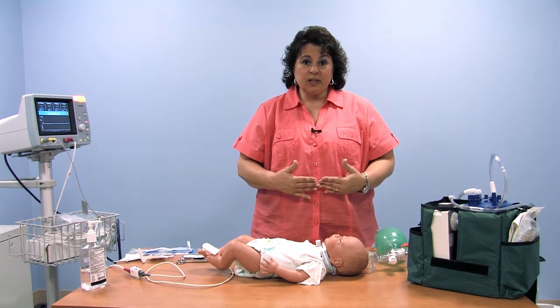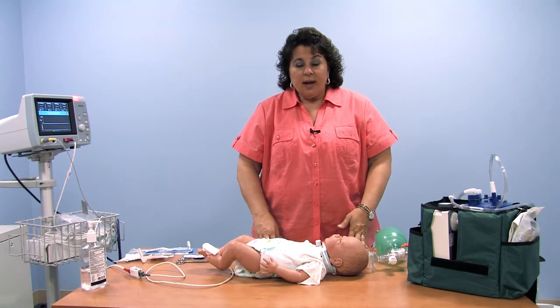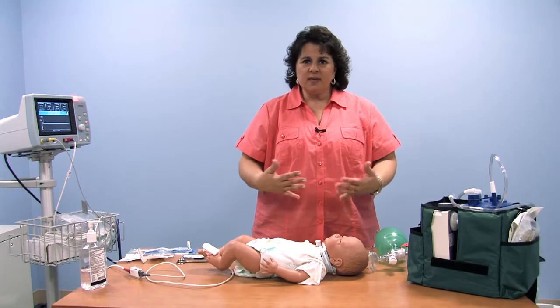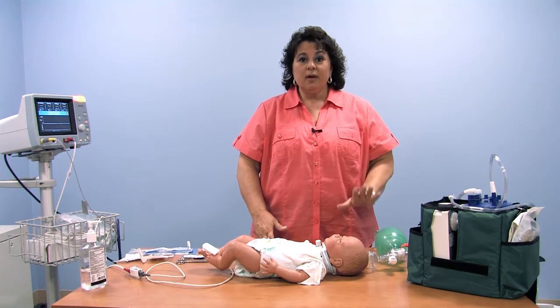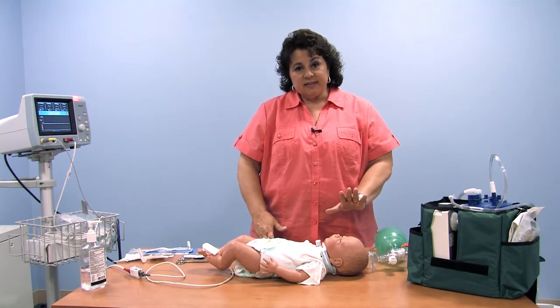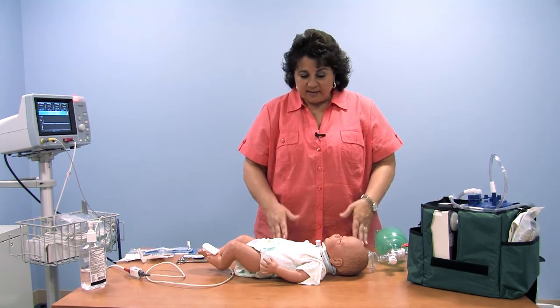Typically, before you leave a facility to go home, you will have all this equipment in place. These are things that you should carry with you in what we refer to as a go bag, so that a child with a tracheostomy tube doesn't travel anywhere without certain pieces of equipment, as well as having them nearby in the home, well marked, hanging right, taped to the bed, or however you prefer to do it, but very visible to those in the home, especially when you have nurses and different care providers coming in and out that aren't necessarily familiar with your home. Make sure the tracheostomy tube is visible, the size the child has in, as well as the next size down, should they have difficulty getting that size in, and other pieces of equipment and supplies that we'll talk about today.